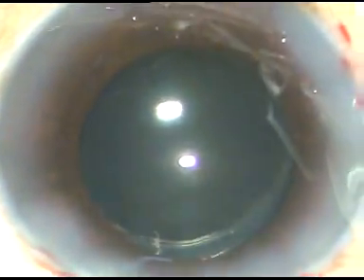Now inject moxifloxacin. And now I hydrate the side ports. After hydrating the side ports, I ask for the Simcoe cannula again, go to a little higher magnification, and gently irrigate so that the irrigating jet goes towards the corneal endothelium — and if any viscoelastic substance is sticking to the corneal endothelium, it comes out. That's it. The case is done. I form the anterior chamber and conclude the case.